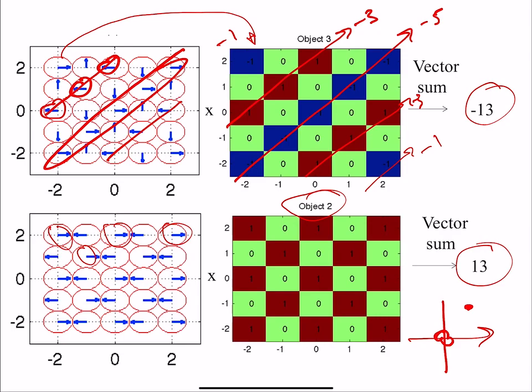Question? And when you say stripes at an angle, it's just that the tissue in that direction is the same and being affected by the gradient the same way? It means that if there was some energy in K-space, it's not necessarily the tissue. In the MRI acquisition process, there can be spikes introduced, and so energy somehow got into K-space at that point.